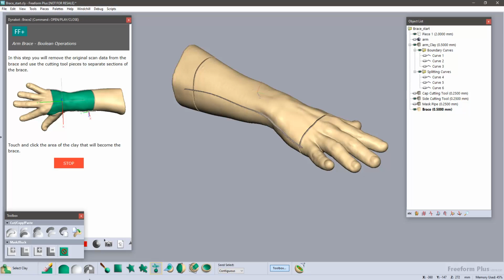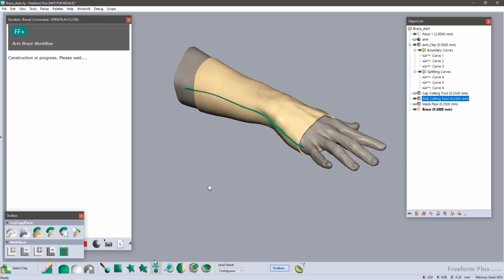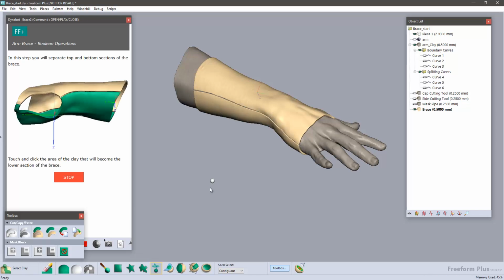This is in the Select Clay tool, and it's using Seed Select. So when I click the clay, it is going to automatically progress. So I touch the surface, click the stylus button, and the Dynabot is doing the rest. So it's removing clay that it doesn't need, trims out other parts it doesn't need, and finally it says to select the bottom of the brace.